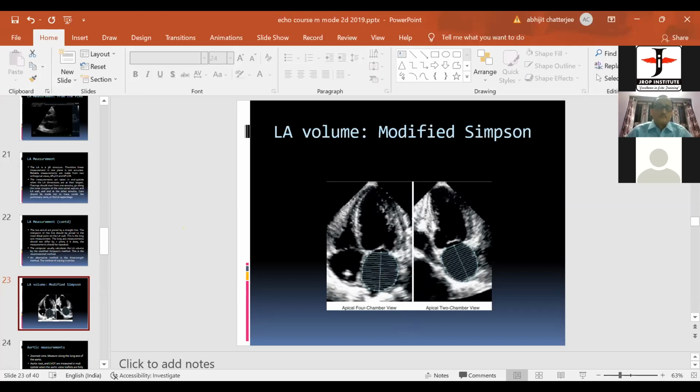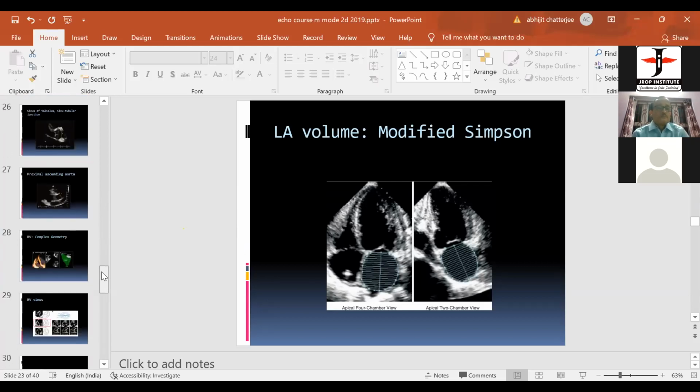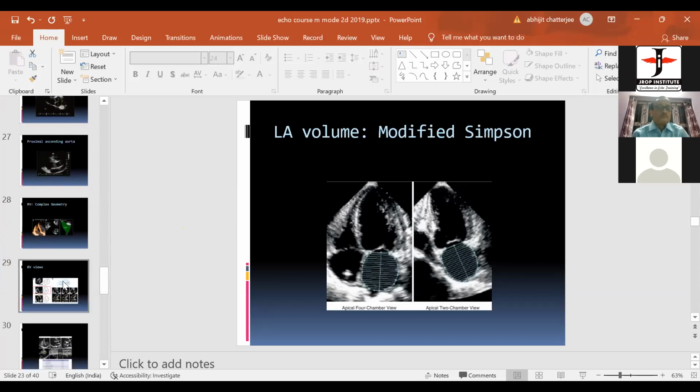Sir, good evening. Good evening, Yogesh. Sir, I just wanted to ask a few queries regarding RVOT measurements at proximal, middle, and distal. How to do that? That was shown, but I just missed it because I was on a call. Just wanted to see that, sir. And secondly, I want to know about RA measurements also, sir.